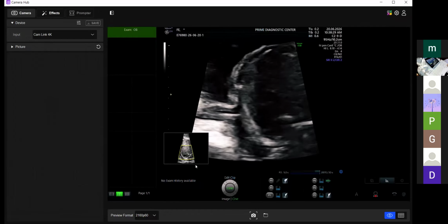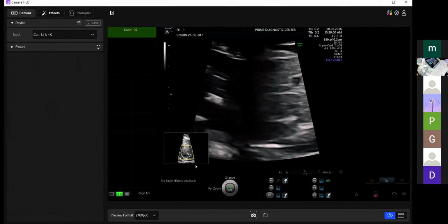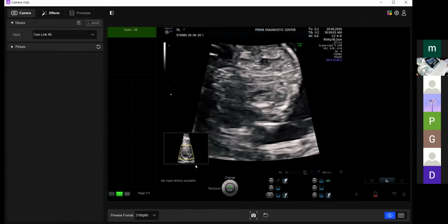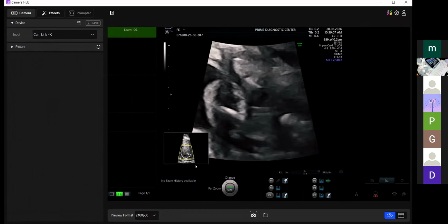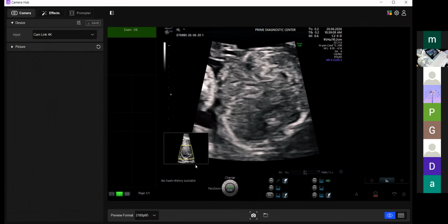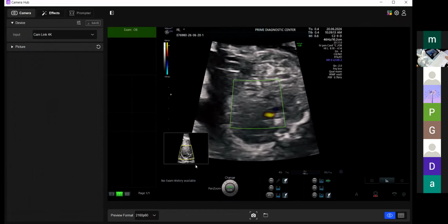All right. Sorry for that. We were on the practice session only. And now, after I finish scanning this, I would make my computer managers a co-host and they can manage that.